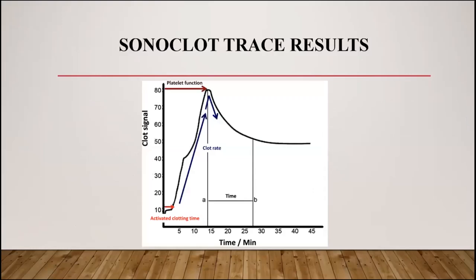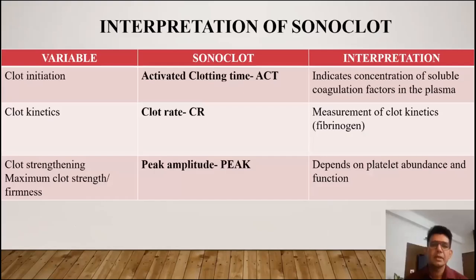It definitely looks very different from your ROTEM and TEG, so you need to keep in mind that the nomenclature of the various time frames would be different. So we'll be subsequently talking about it.